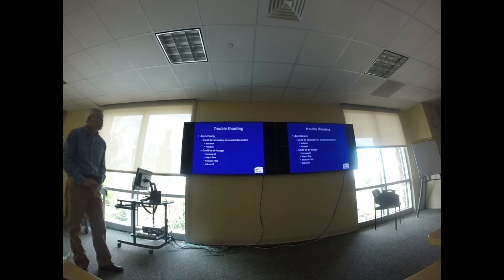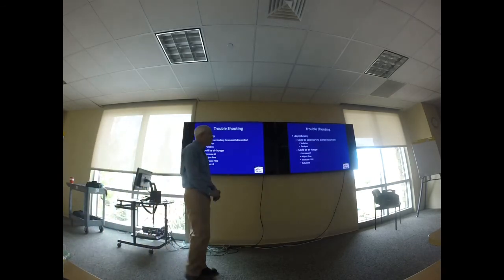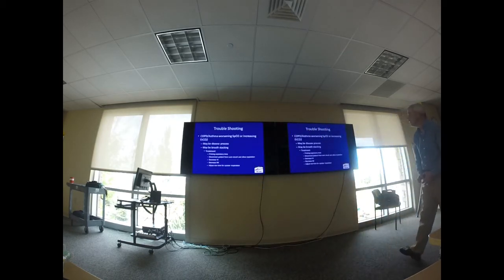Asynchrony could be secondary to air hunger too, right? So maybe you're not giving an appropriate amount of tidal volume. Maybe you need to adjust your bias flow. Maybe you need to give them a little bit more flow through the circuit so they're not trying to pull in too much. Maybe you need to give them more pressure support. I don't know. Maybe you need to give them more oxygen or adjust your inspiratory to expiratory ratio.